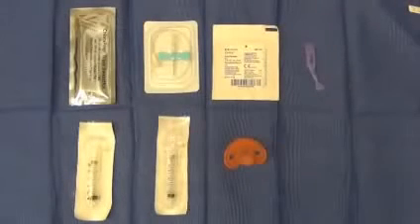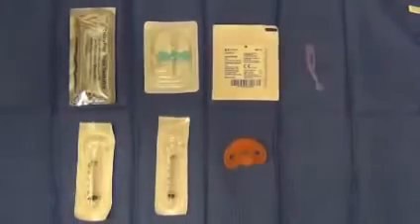A 23-gauge or 25-gauge blood collection set. A 3-ml or 5-ml syringe for aspiration and blood collection. Gauze pads to tamponade the hemorrhage when the sampling is complete. A pacifier and sucrose solution for pain control measures.